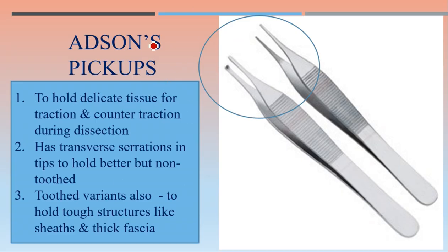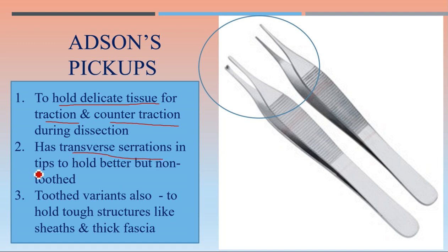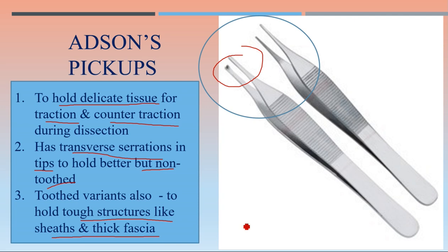Another one is Adson's pickups — slender, with a smaller slender distal end. The classic Adson's pickups are plain without any tooth, though toothed variants are also available. It is used to hold delicate tissue for traction and counter-traction during dissection. It has transverse serrations. The toothed variants can be used to hold tougher structures like sheaths and thick fascia. Adson's pickups are very commonly used in plastic surgery and general surgery.